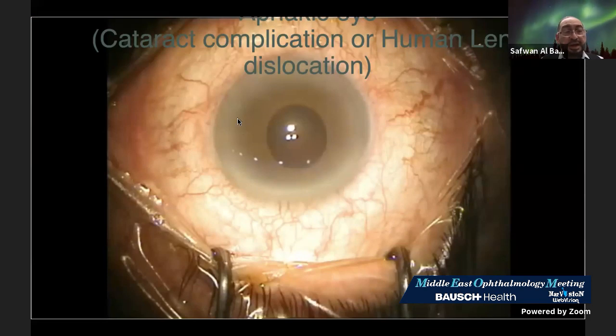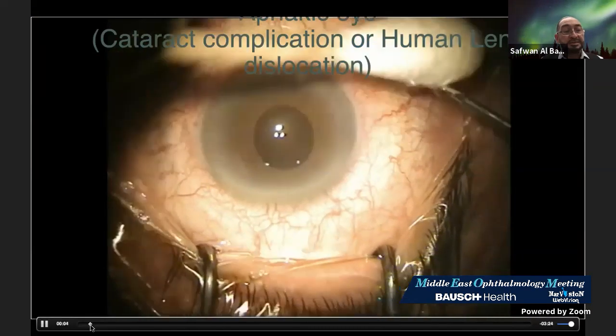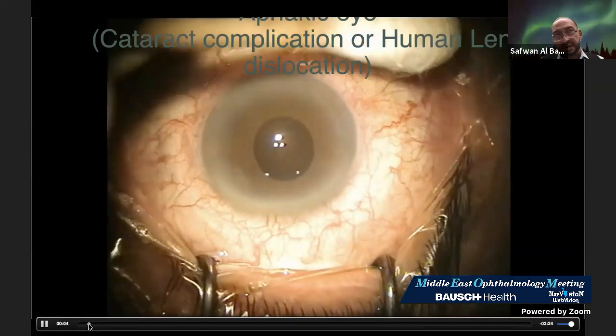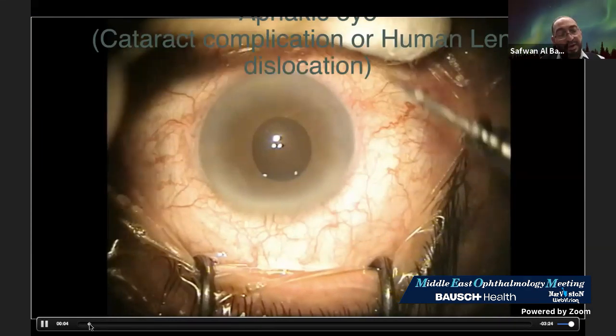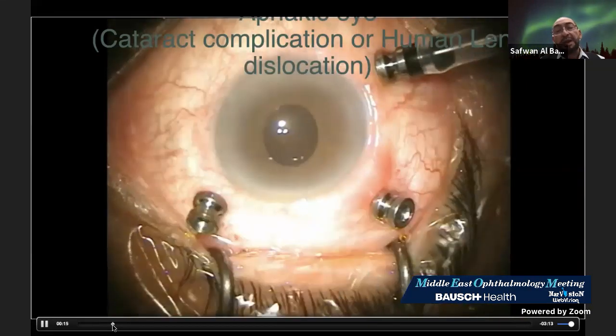Now, if we go to the surgery, here I will try to grasp and see. In this case, I used vitrectomy because the case presented with a cataract complication and lens matter was in, so I used the 3-port entry. I will go through slowly here just to show a few tips. When I passed the 3 trocars, the temporal one, the infusion, and the upper one, it was a little bit away from the other, leaving the area at 3 o'clock to be peritomized.